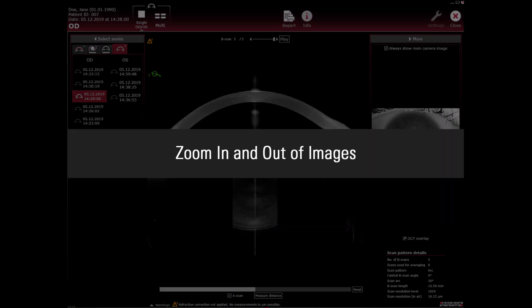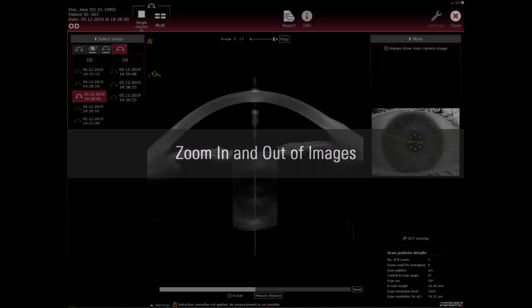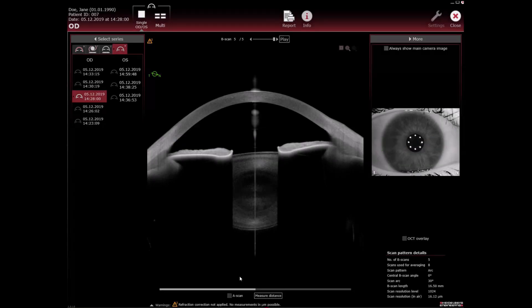Zoom in and out of images: To zoom a selected region to its maximum size, click plus.